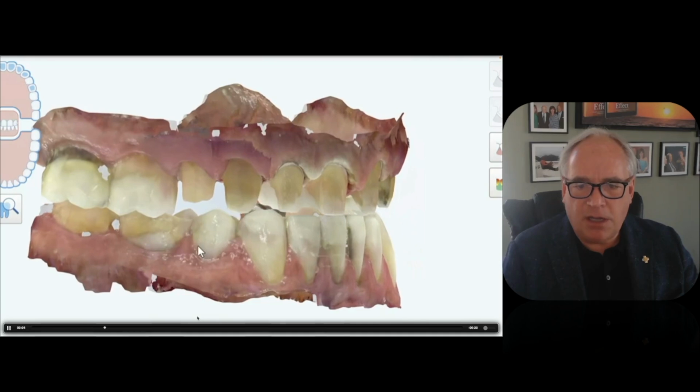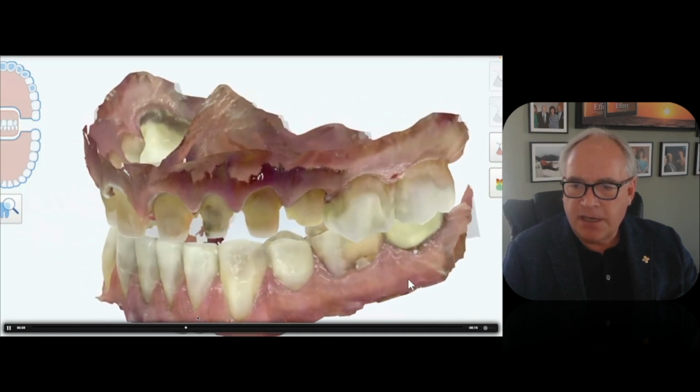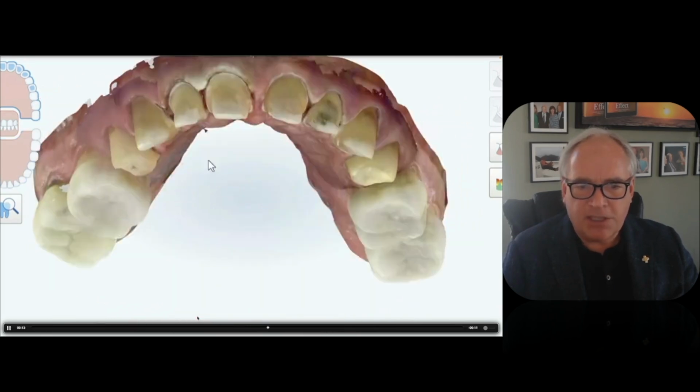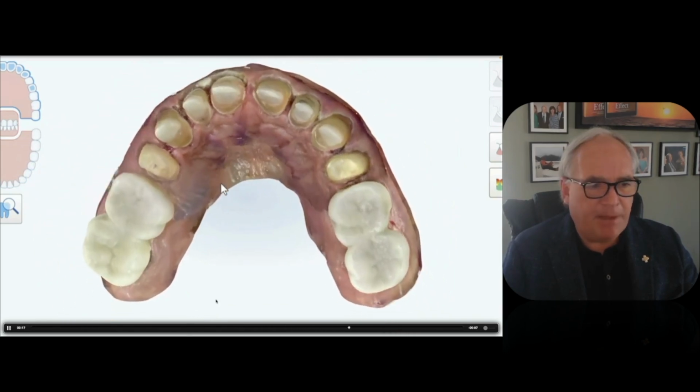Again, good clearance everywhere and good retraction. And again, CR and MI are the same now. So we're just having the patient bite and they will copy from here. One of the powerful things about digital is once we have a good design, the lab can copy and paste. If they have the file where we did the design for the wax up or the file that they made the provisionals from, if we like that, then they can just cut and paste and keep using that file.